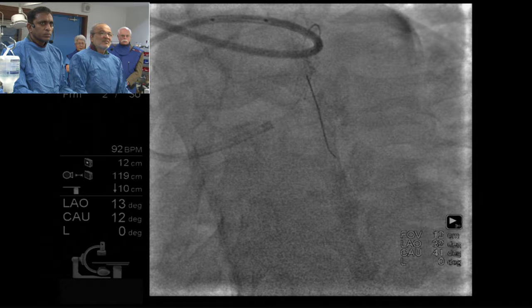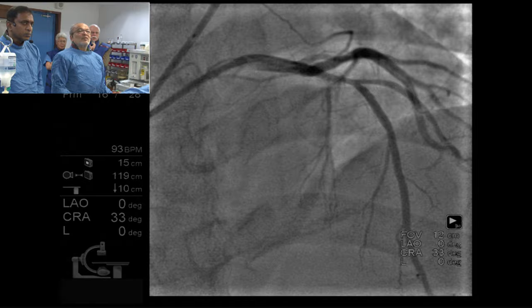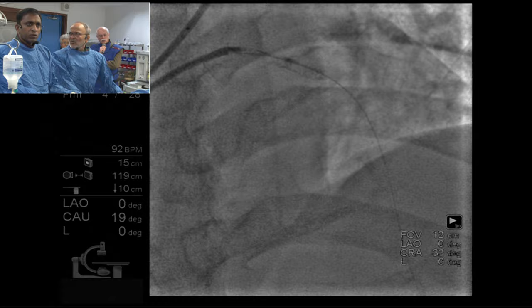What do you guys think? I think some of it may depend on what kind of procedure was done initially. Did they use a lot of brute strength on it, a lot of manipulation of the artery? That can also set you up for this too.